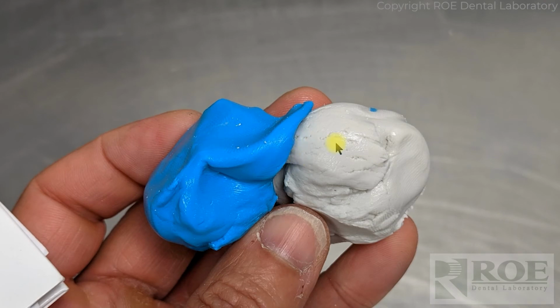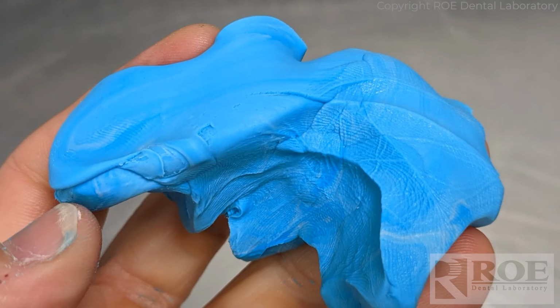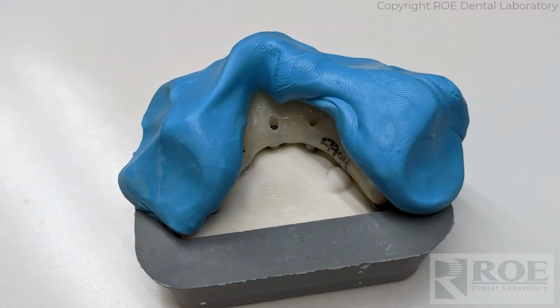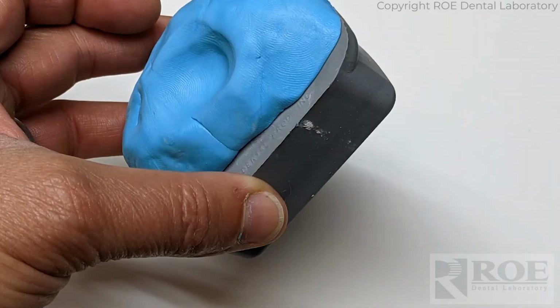Then take a laboratory putty material of equal size, usually it's a 1-to-1 ratio. Knead it together until you have a nice wad of putty, for lack of better terms, and simply wrap it around and over the prosthetic to completely engulf the prosthetic. And you'll massage it and push it and kind of force it even a little bit into the undercut, not too much, but it'll find its way in there. You can even put a little divot in the middle with your thumb, and that way it pushes into the intaglio of the prosthetic. And then let it set.